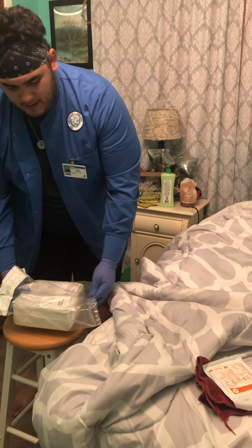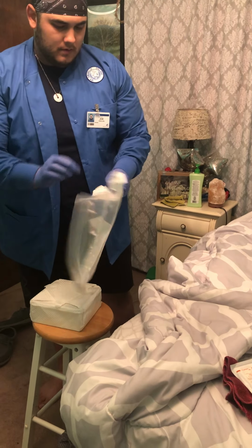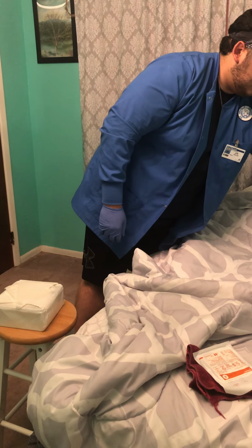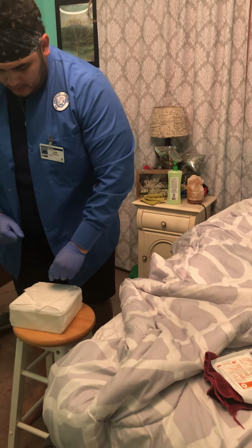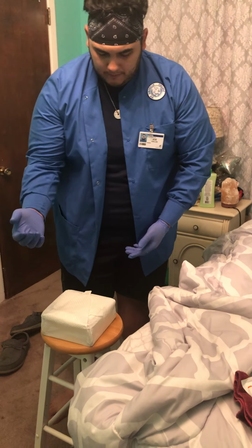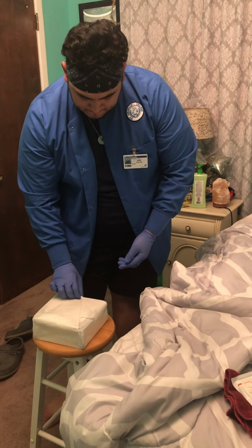So the outside of the package is not sterile. And we can use this to kind of dispose of our things as we go. Alright, so when opening this, the first flap always goes away from you, and you always want to grab just the outer inch only.